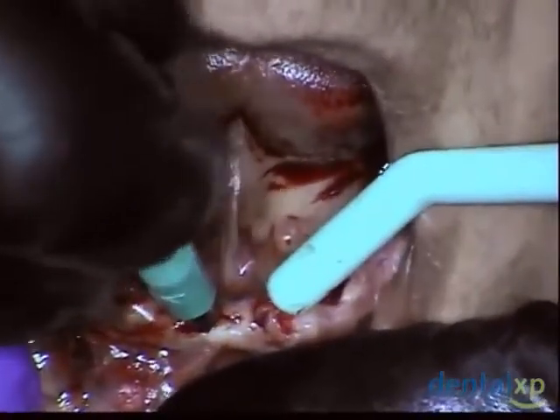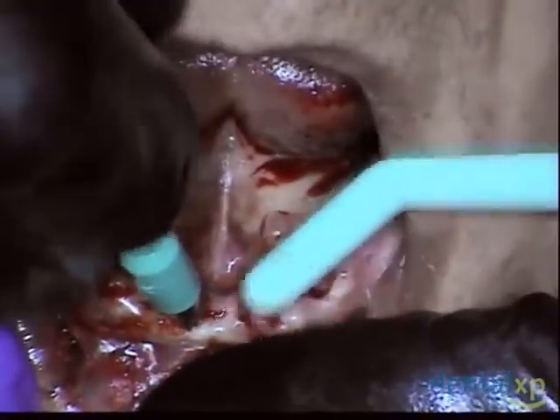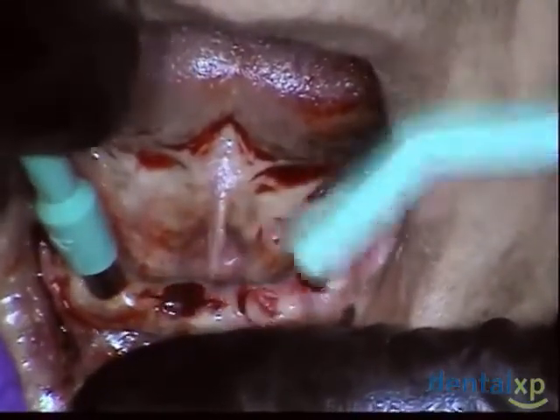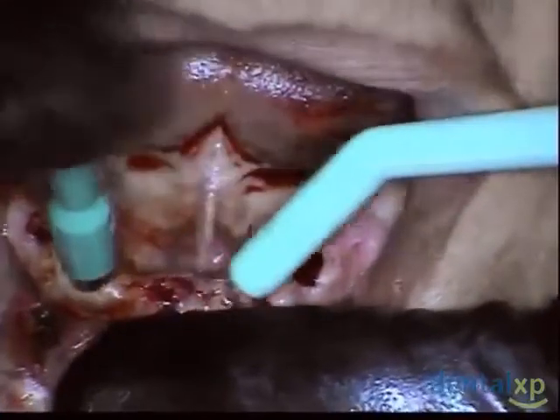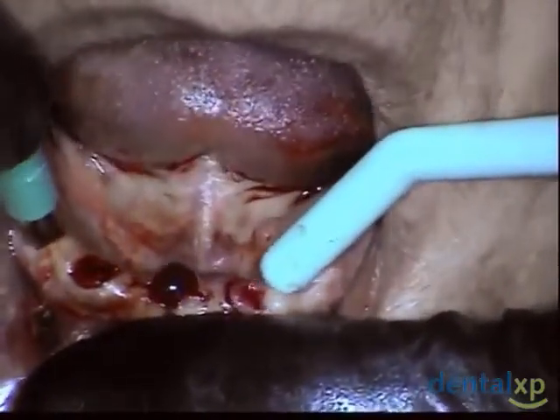Now you see I move that facial aspect of that tissue facially so my tissue punch will not affect it, but it will clear the area that we need to be cleared. It's not a problem actually to lay a flap. I have no problem with it.